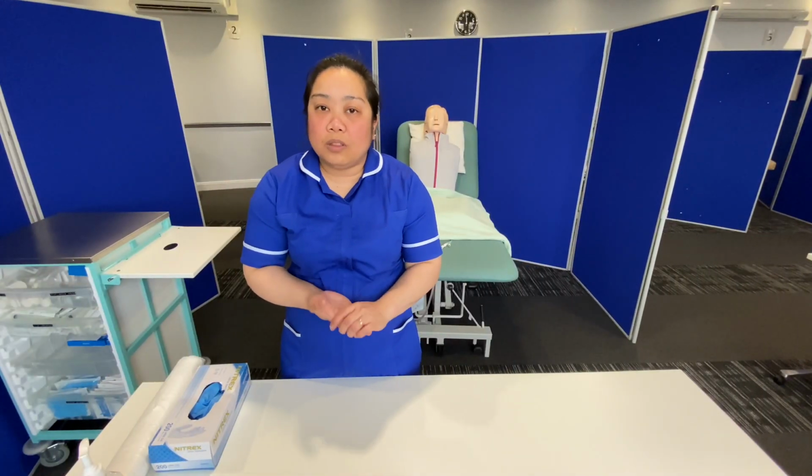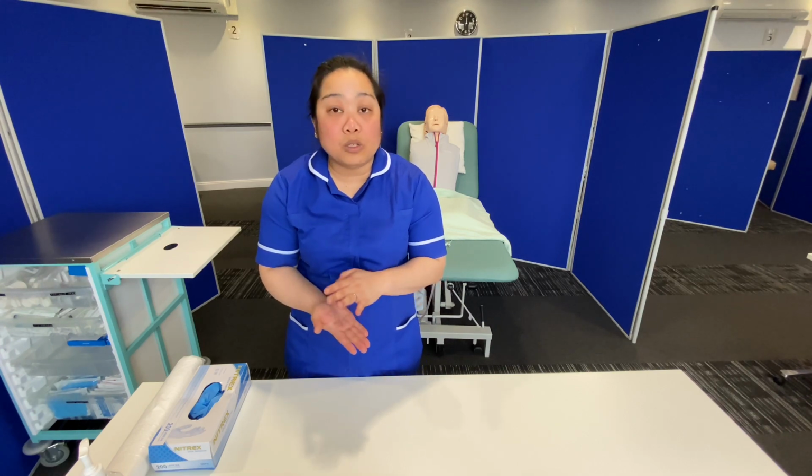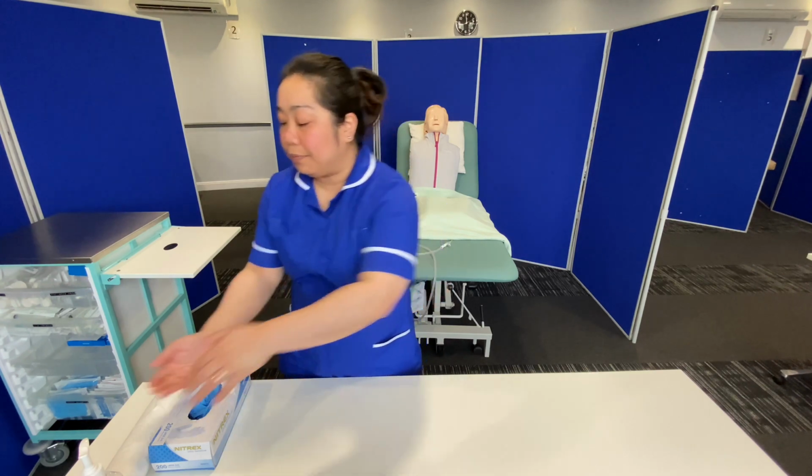Before proceeding to go to the patient's bedside to collect a CSU or a catheter sample of urine, I must first prepare my materials that I need. Before doing so, I will do my hand hygiene and don my PPE.